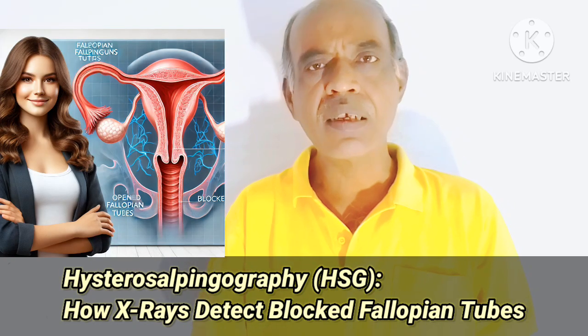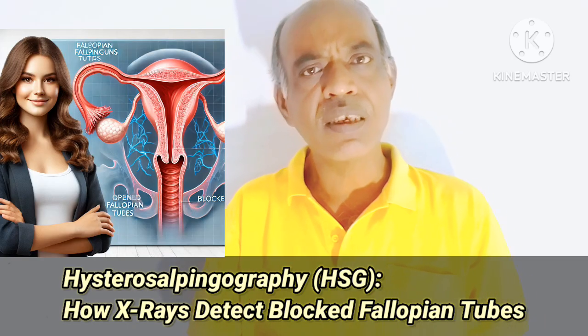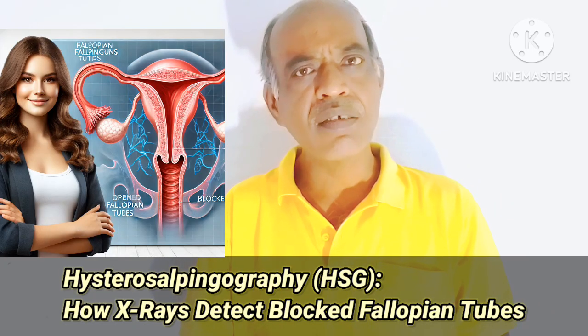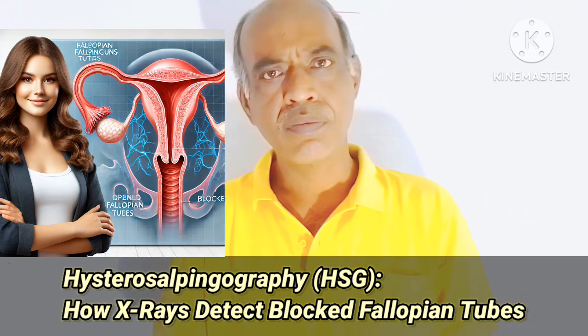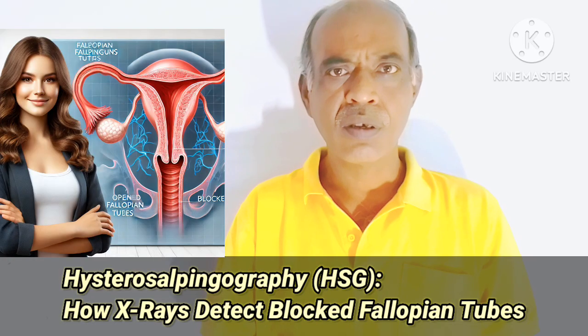So doctors can easily see whether there is any blockage or not. If there is a blockage, the dye stops at a certain point, and if there is no blockage, the dye can smoothly flow through the fallopian tubes. For that purpose, radio opaque dye is used.